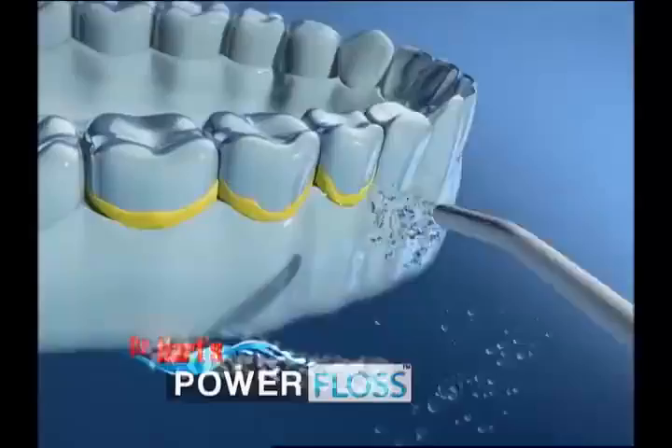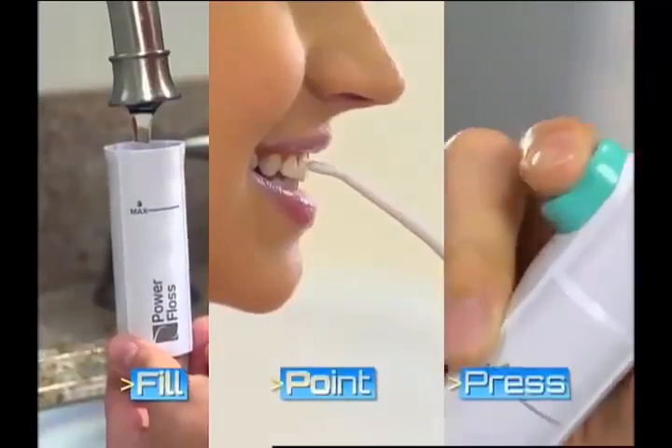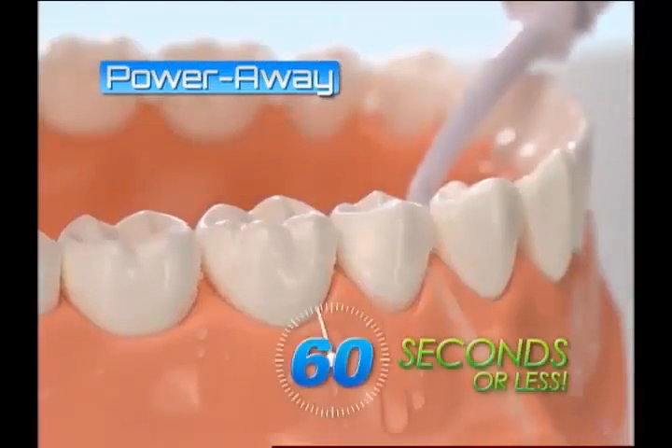Introducing Dr. Hart's Power Floss, the fast, easy, pain-free way to floss every day. Just fill, point, and press to power away plaque-causing debris in 60 seconds or less.